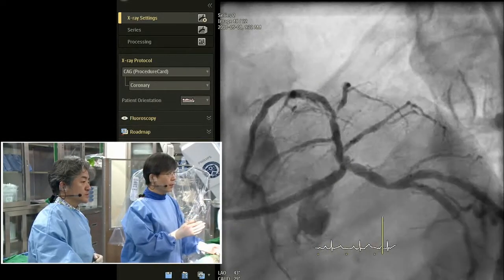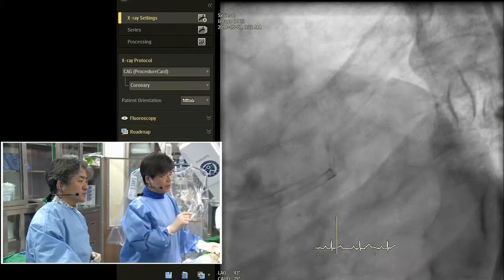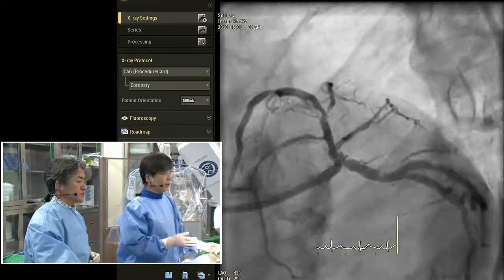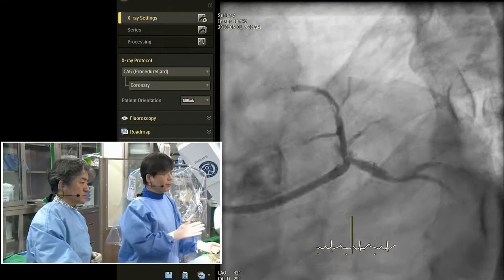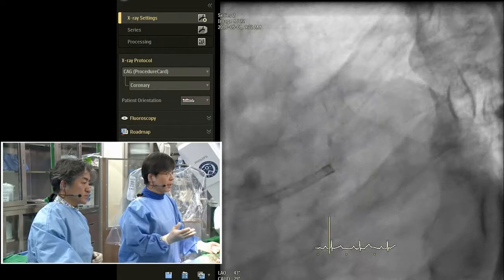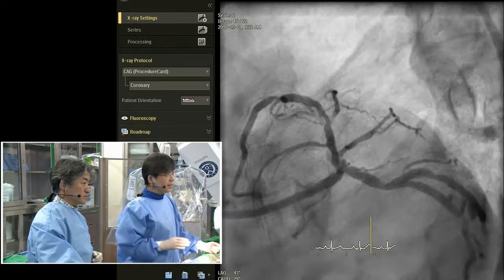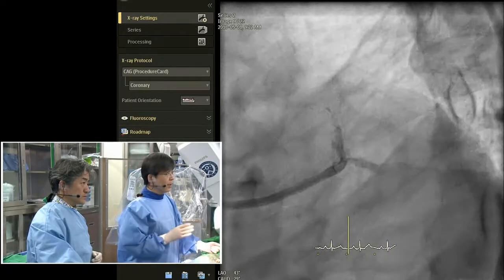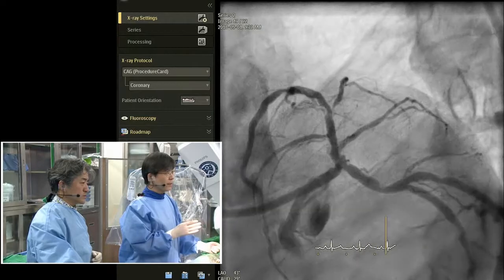This is the spider view with some severe angulation, but the ostium of the circ is severely narrowed, and there is some suspicious plaque rupture between the LAD and the ostial circ, and some linear haziness of the LAD ostium, and the more distal mid-LAD is significantly narrowed.